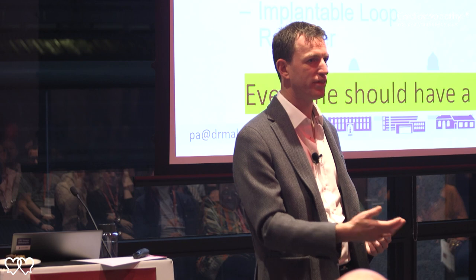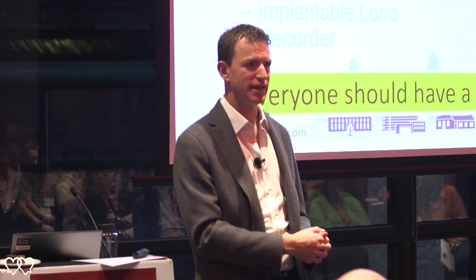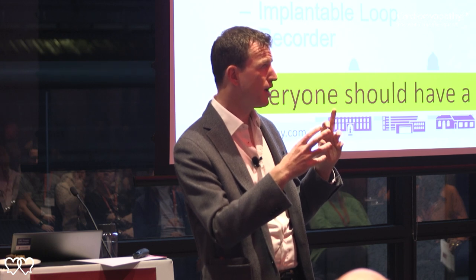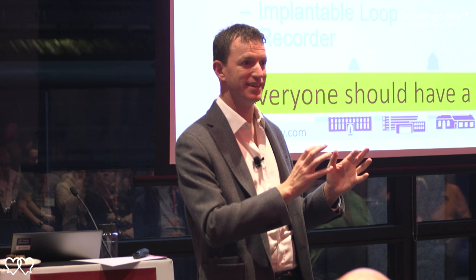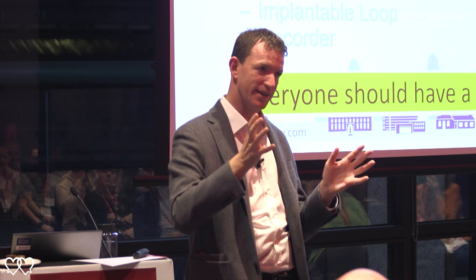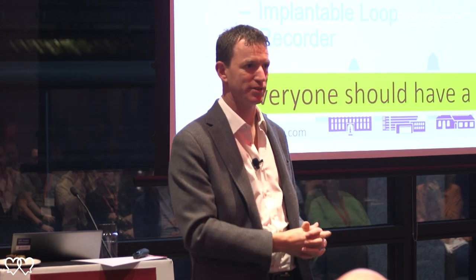So that's another subscription that these companies have then said, well, this is actually a bigger cost than we had thought. So then anytime there's a basically quite a simple alert-based system that sends a transmission, and then there's a team in the Netherlands who will look at it, say yes, this is a real thing, and then send that to the hospital. So there's a manual process in it still.